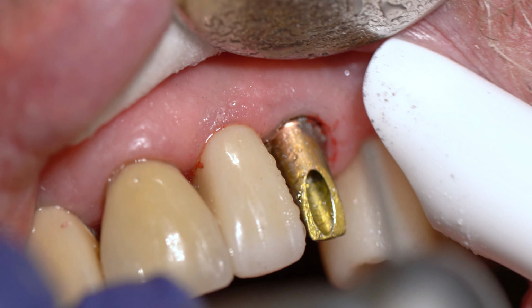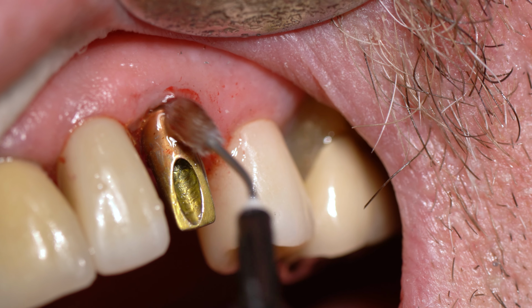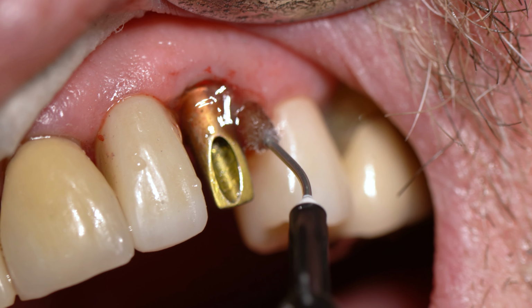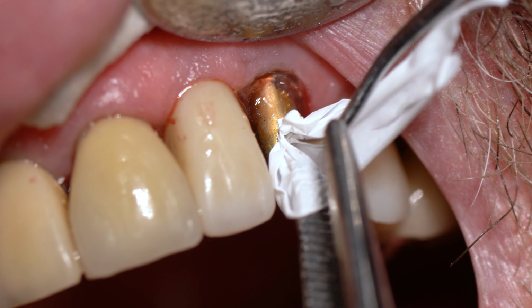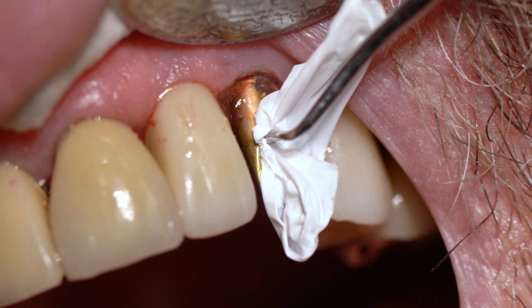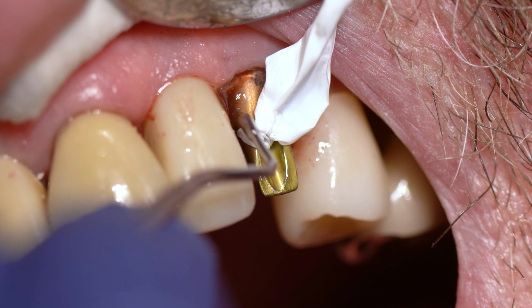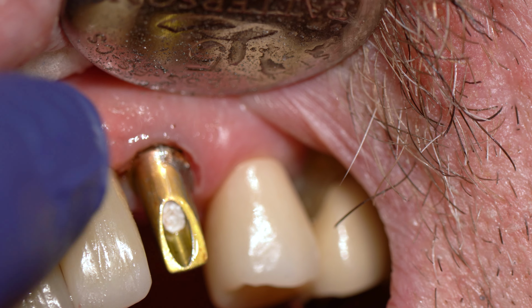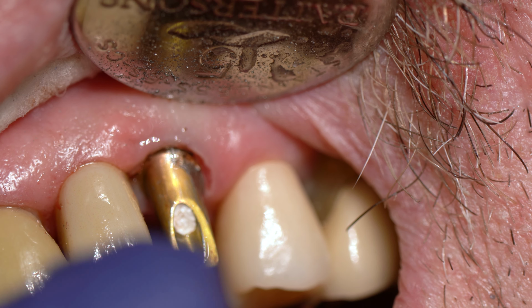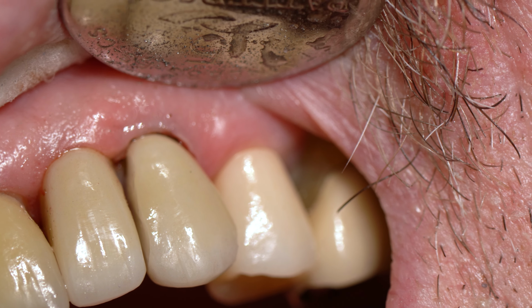And you'll notice I did nick the gums a little bit, so I'm going to apply some hemostatic agent, because otherwise taking my impression will be a big pain in the butt. So I'm applying a hemostatic agent here, and that's just going to make it so I can take my impression. All right, so now I'm putting some Teflon tape in here. You don't really need to, but it just makes for a cleaner impression. Otherwise, stuff can get stuck inside the access channel, although it usually comes out in one piece. So I'm packing that in there. And now I'm going to apply some Vaseline. I'm just double checking that everything fits really well.